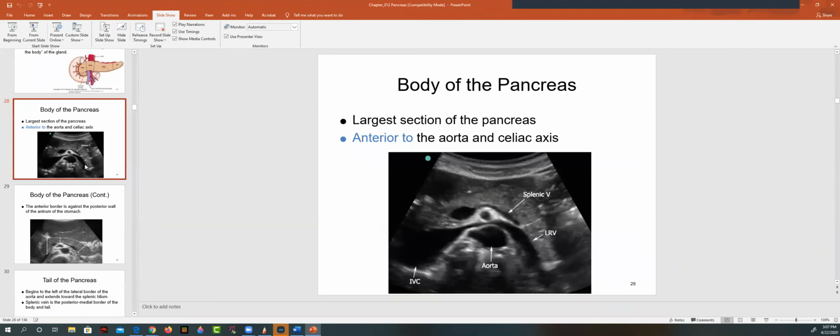It's always good to see if there's anything relevant. It's kind of cool. This aorta is normally quite round. We've got a little knob over on this side. That's the base of the right renal artery. And here's a beautiful left renal vein going all the way across and dumping into the IVC here.